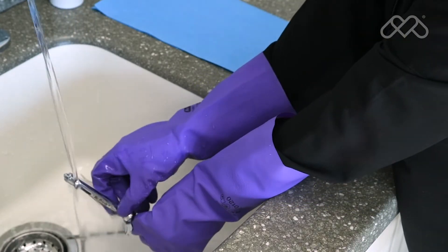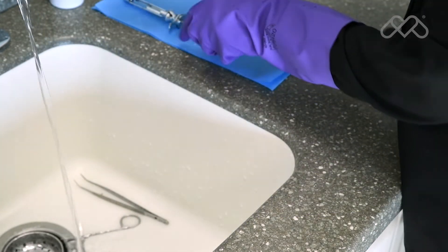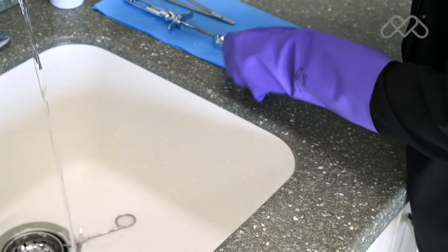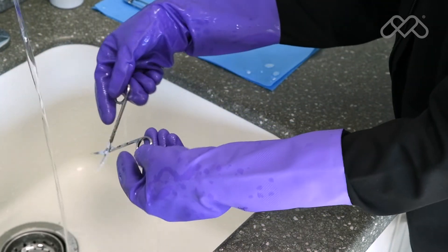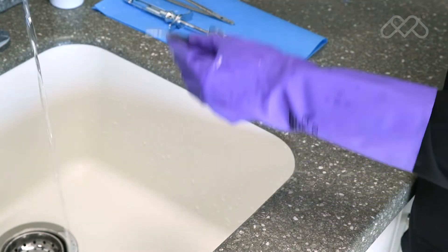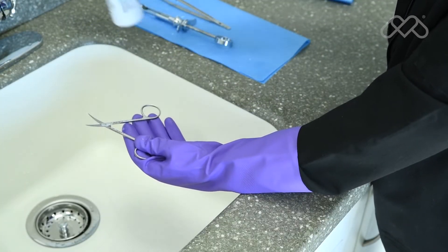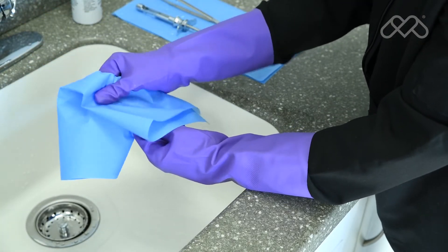After cleaning, thoroughly rinse instruments with tap water to remove any loosened debris or residual cleaning fluid. It is recommended the final rinse be done with water of adequate quality to avoid instrument staining. After rinsing, instruments should be inspected for damage, debris, and detergent residue, then dried completely before packaging. If lubrication is required, wipe off excess lubricant before packaging the instrument for sterilization.